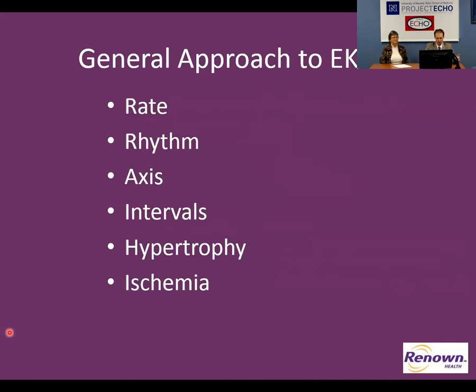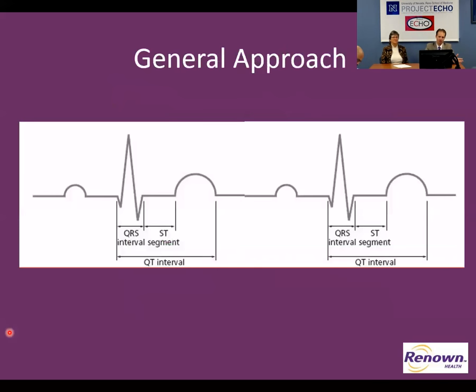And most importantly, I think, is that putting ischemia last will help you to not miss other things, because most people, oftentimes, myself and other practitioners, will look for ischemia first. And of course, that's often why we got the EKG, but maybe not the most important thing.